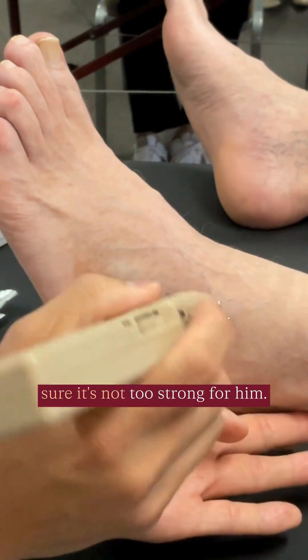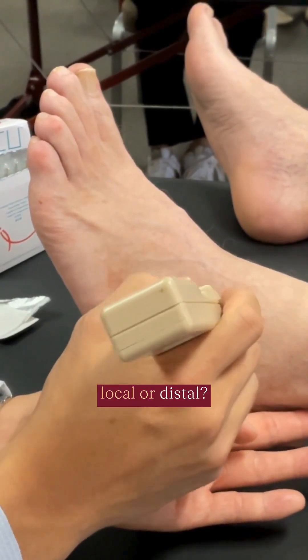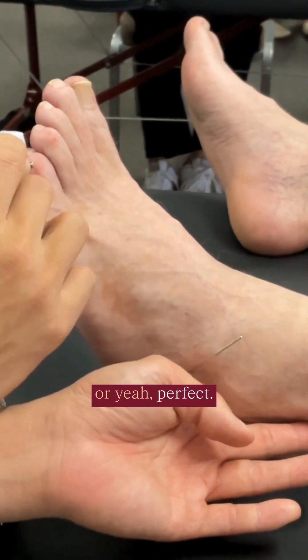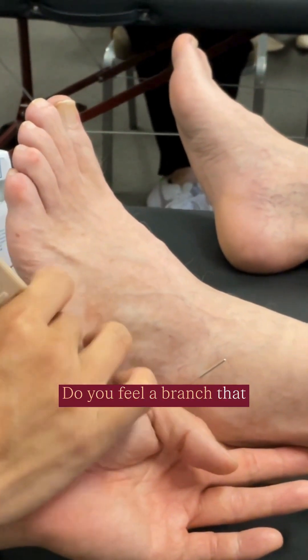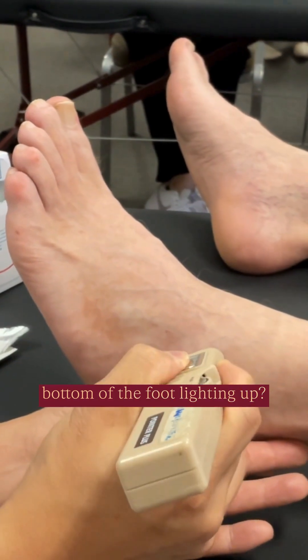So you do a quick touch — make sure it's not too strong for him. Is that okay? Do you feel anything local or distal? Perfect. Now hone in a little bit. Do you feel a branch that goes to the bottom at all? Do you feel a little bit of the bottom of the foot lighting up?